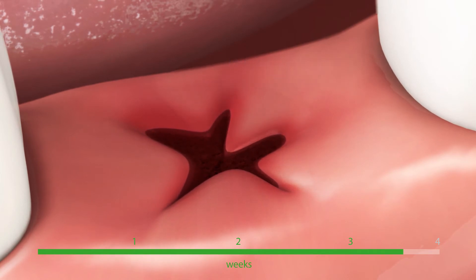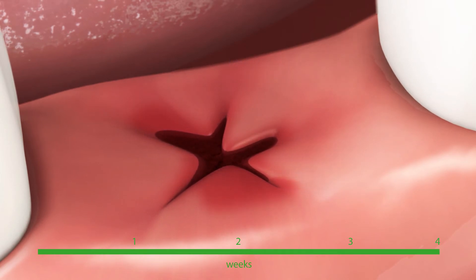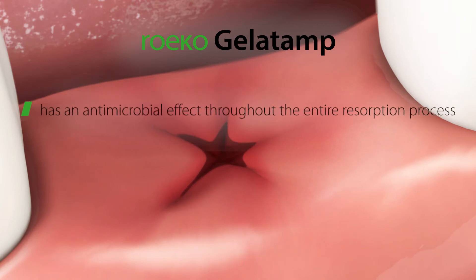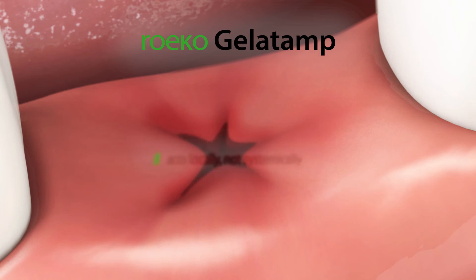This gives Gelatamp a depot effect. The sponge has an antimicrobial effect throughout the entire resorption process. Because the silver in Gelatamp acts locally rather than systemically, it is very well tolerated.